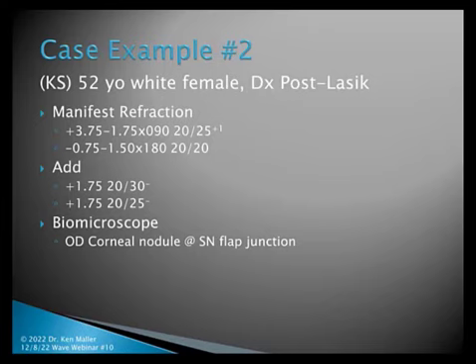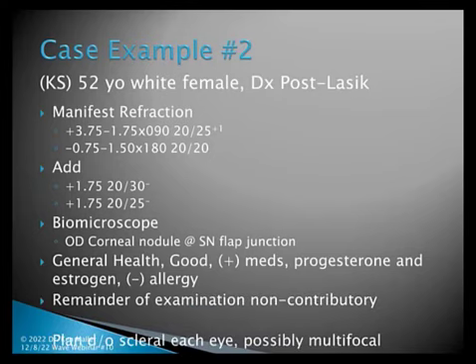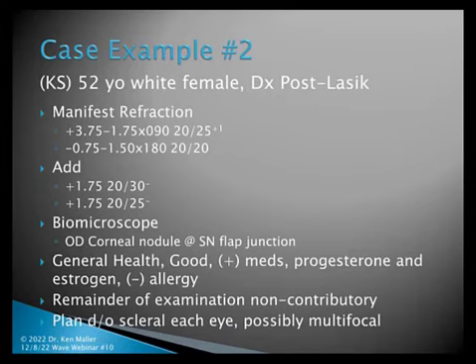vision and/or physiology. Health is good. She's on progesterone and estrogen, no allergies, and the rest of the exam was non-contributory. So I planned her a distance scleral lens in each eye, but we also talked about if I can get everything working well, I might fit her into a multifocal, which made her very happy.